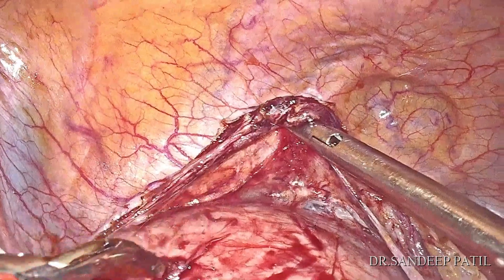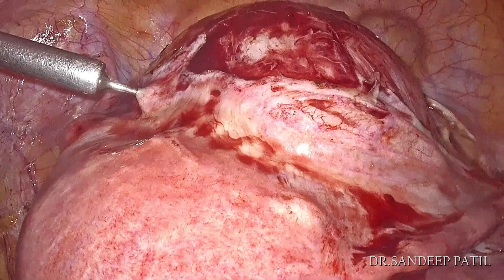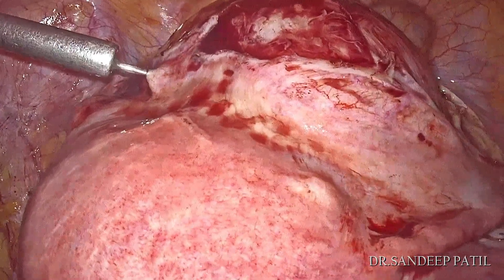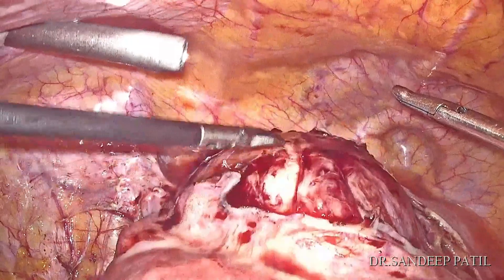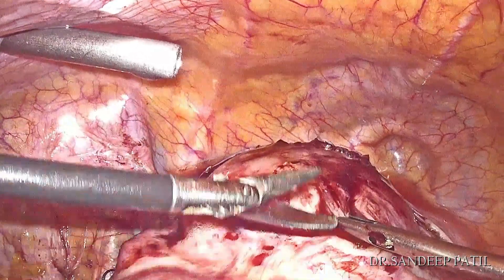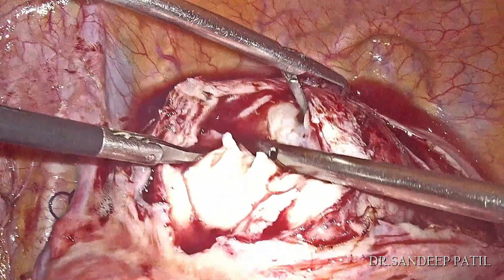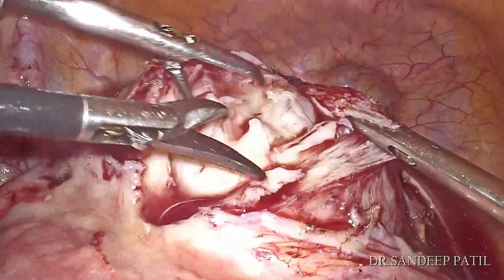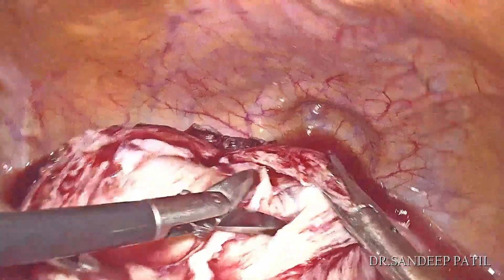The next step is injection of diluted vasopressin at the junction of the fibroid and normal cervical tissue. The dilution used here is one ampoule of vasopressin in 200 ml of normal saline. We infiltrated around 100 ml of diluted vasopressin and proceeded for the next important step of myomectomy incision over the cervix.